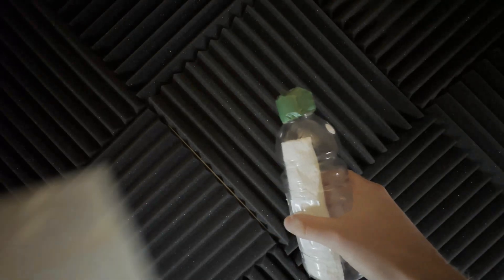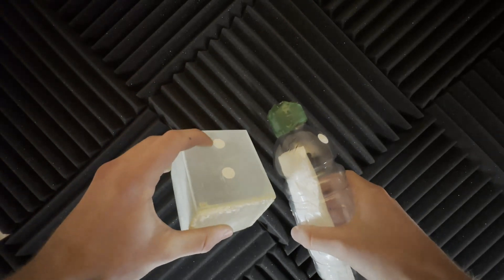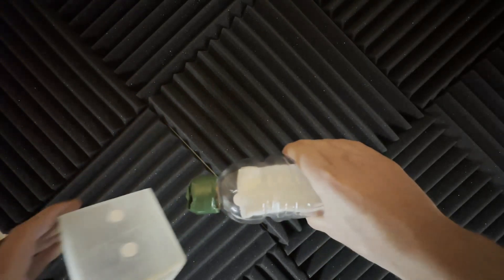All in all, the final prototype consists of components utilized in both the alpha and beta prototype, with improvements in the hole diameter, bonding the material, and functionality.